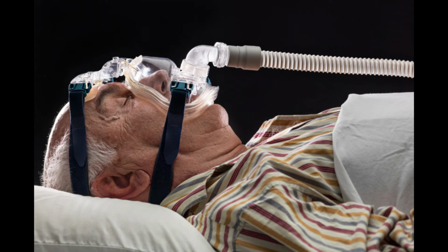If we're not able to resolve the mask leak over the phone, certainly invite the patient to come in, and I'll have them demonstrate again how they put on the mask, and we'll try to go through all of the steps and see where the leak is occurring, if it does leak, and go from there.